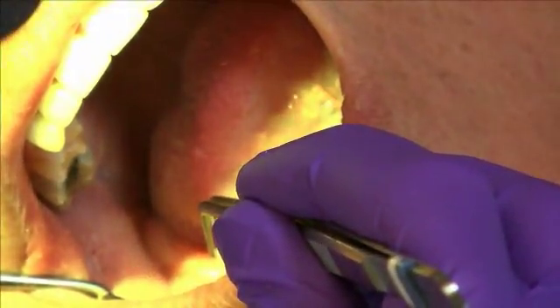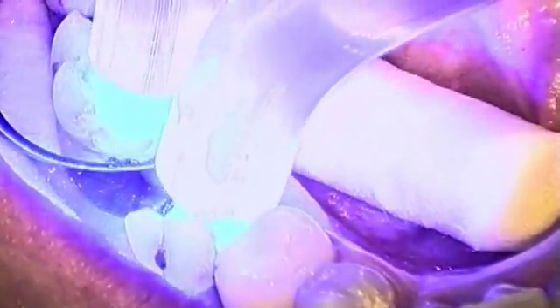Place the post in the root canal filled with cement and apply moderate pressure to hold it in position. We recommend rotating the post slightly during insertion to avoid the inclusion of air bubbles. Light cure the cement for 40 seconds, or allow to self-cure for 5 minutes from the start of the mix.